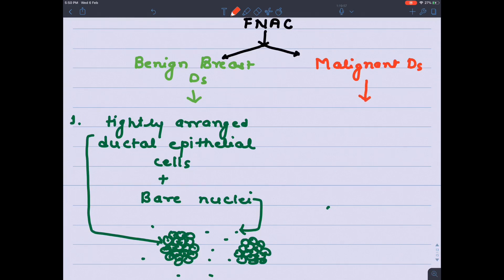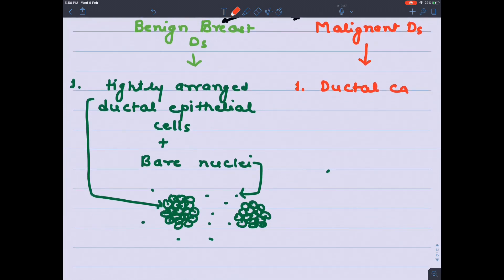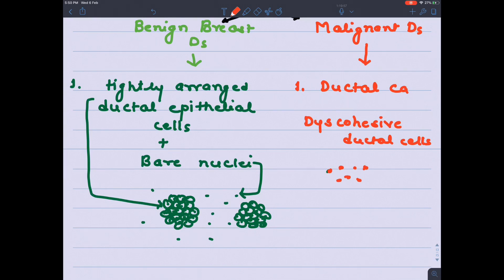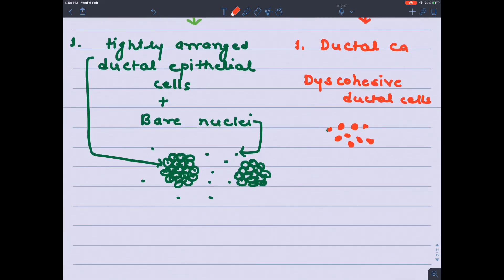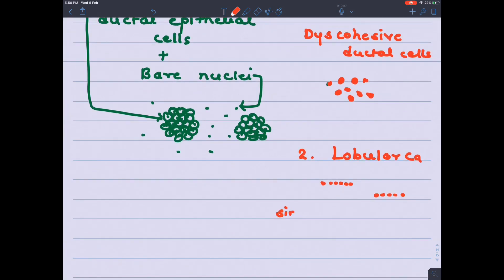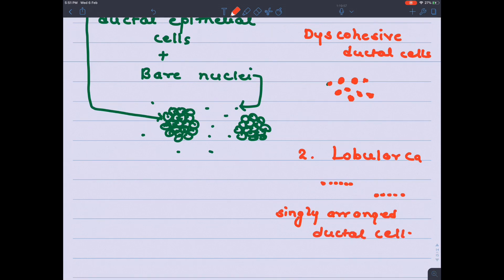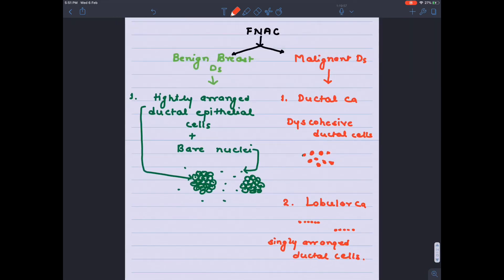To identify malignant disease: for ductal carcinoma, you will see the opposite of benign breast disease. Instead of tightly arranged ductal epithelial cells, you will see discohesive ductal epithelial cells showing malignant features, scattered here and there on the slide. For lobular carcinoma, the cells form a proper line — singly arranged ductal epithelial cells forming a single file, which equals lobular carcinoma.